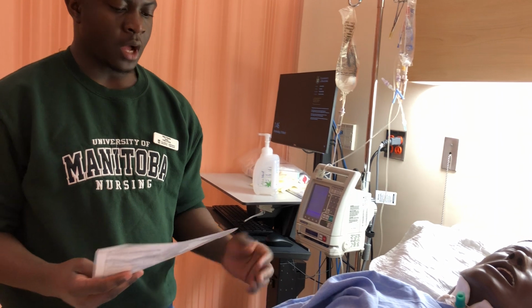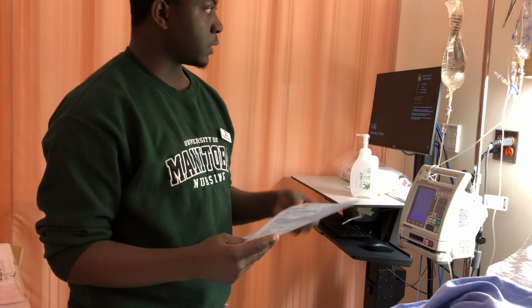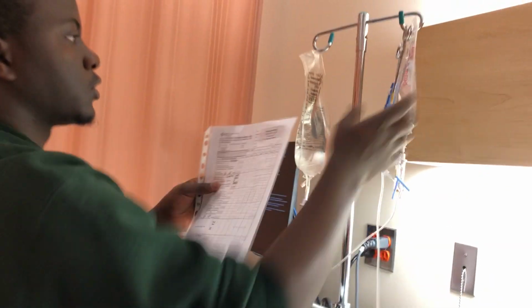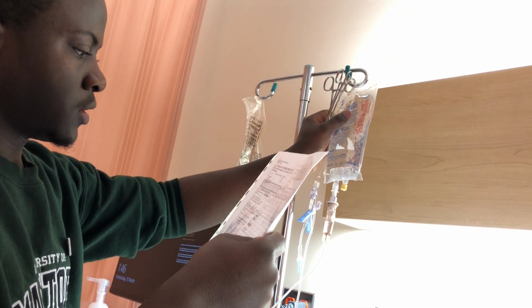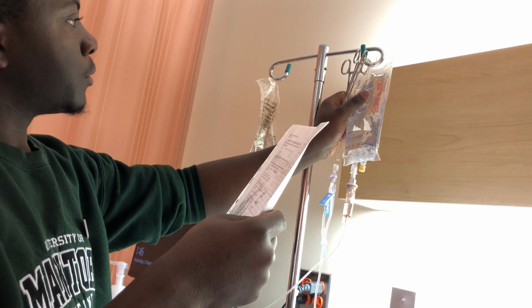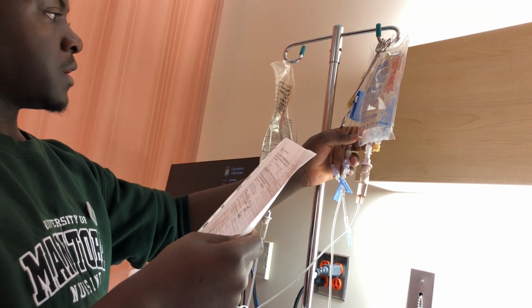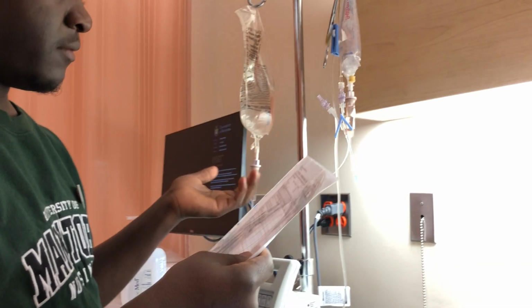As the nurse told you, this is to prevent blood clots. She already prepped and started it, so I'll just be starting this infusion. I'll go ahead and double check my heparin bag here to make sure that I have the right bag. So I see here is heparin in 5% dextrose, which is as in the MAR, and it's 25,000 units in a total volume of 250 ml. And I'll just check the expiry date. I see it expires in August 2014, so I know it's not expired.